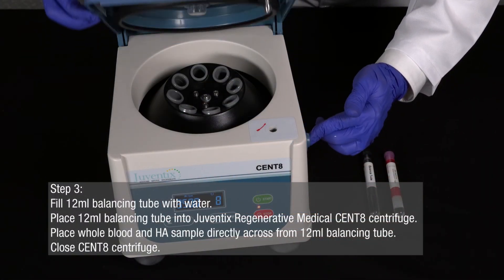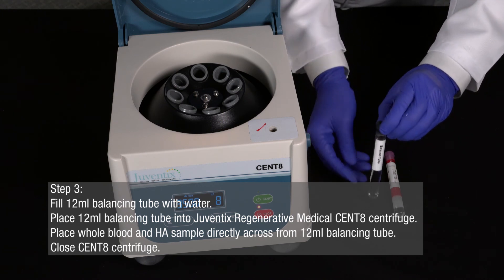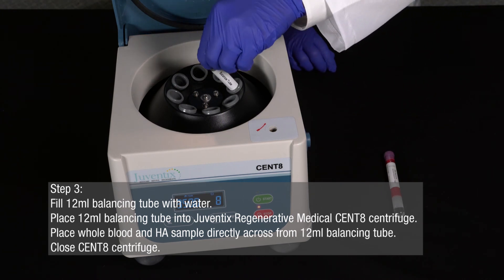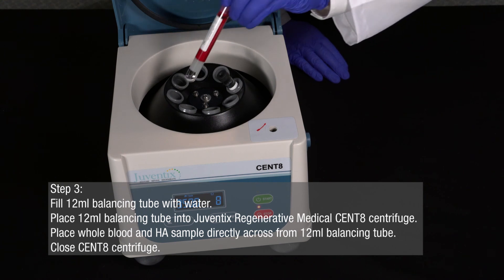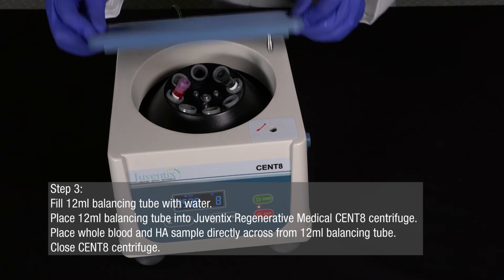Fill the 12-milliliter balancing tube with water. Place the 12-milliliter pre-filled balancing tube into your Juventix Regenerative Medical Cent8 centrifuge. Place the whole blood and hyaluronic acid sample directly across from the 12-milliliter balancing tube and close the Cent8 centrifuge.